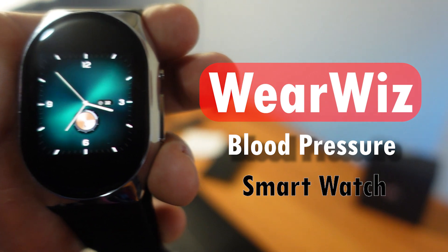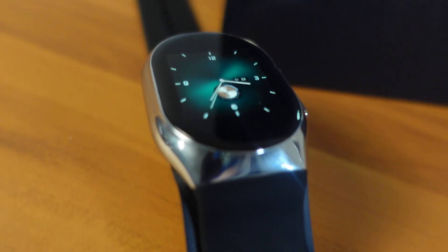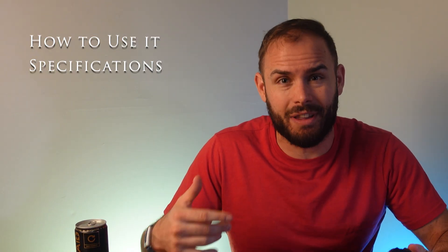Welcome back to the channel — today on Fitness Tech Reviews, Wiz sent me their blood pressure monitor smartwatch. There's been a lot of rumors about the Apple Watch or even the Samsung Watch being able to track blood pressure. This is the first watch I've gotten my hands on that can actually track blood pressure. I'm going to go into how to use it, the specifications, and whether it's really meant for you.